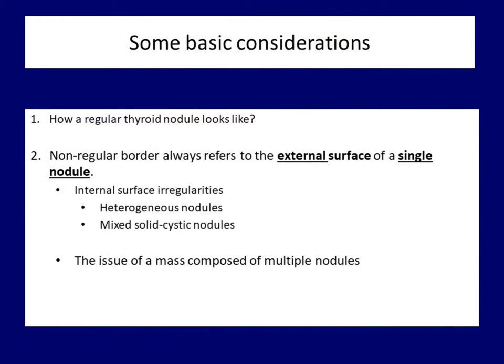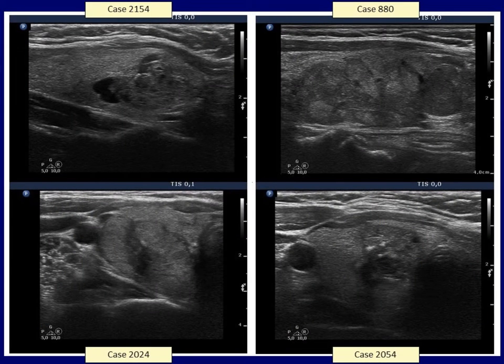It is more difficult and not infrequently impossible to resolve whether a mass is composed of multiple nodules or should itself be held as one nodule. As a rule, the margins are referred to a single nodule and not to that of a mass composed of multiple nodules. In the left upper image, the judgment is relatively easy. This mass is composed of multiple nodules, which makes the appearance of the surface of the entire mass undulated, similarly to an individual raspberry made of numerous droplets. So the margins in the left upper case should not be held as irregular.